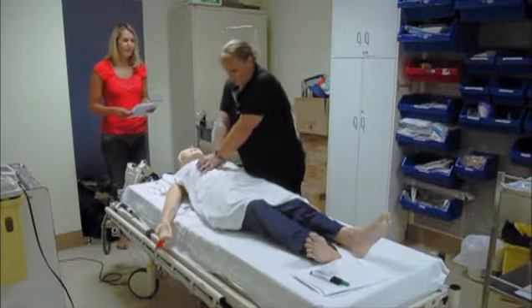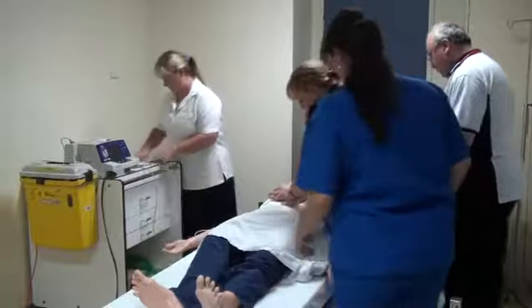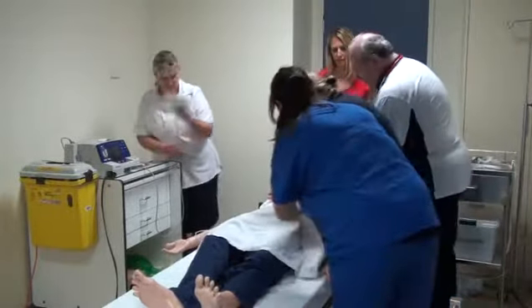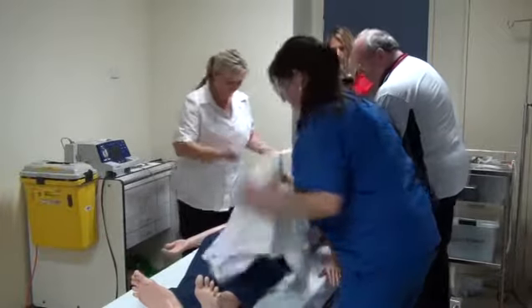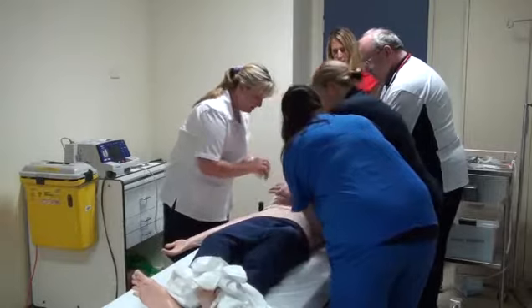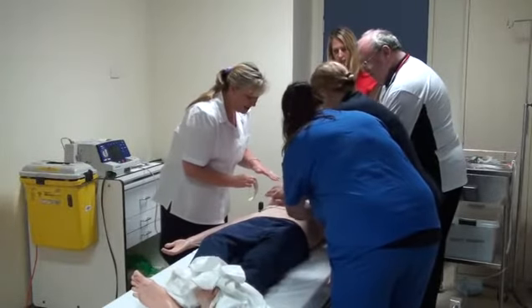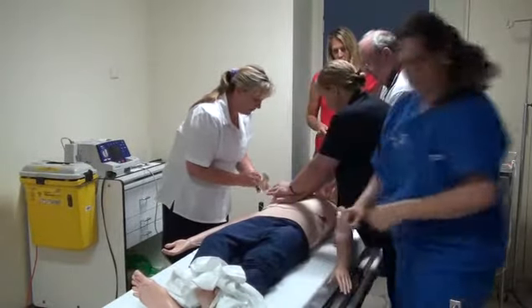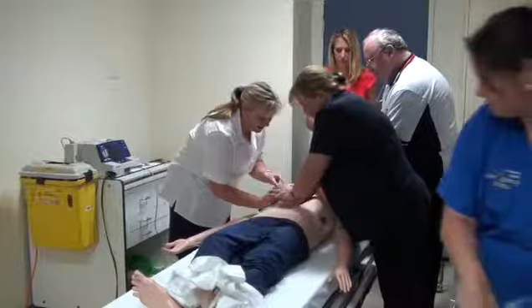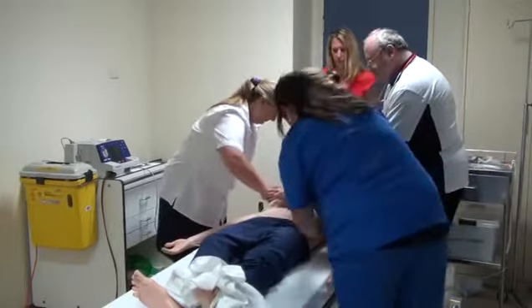1, 2, 3, 4, 5, 6, 7. What's happening? I found this patient unresponsive and unconscious. Does he have any access? No access. I'll just take the pads. I'm just going to put the pads on. I'm going to make sure that the chest is nice and clean and dry, and I've got no ECG dots or jewellery. I'm going to roll them on to get good connectivity.